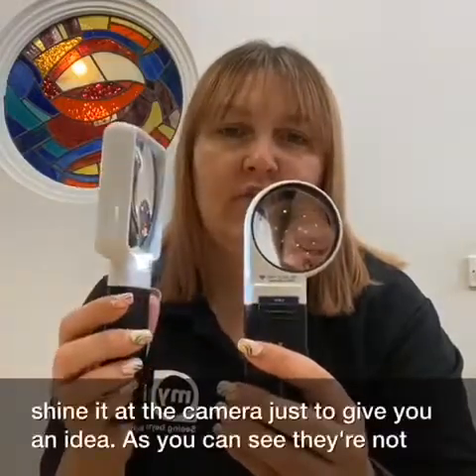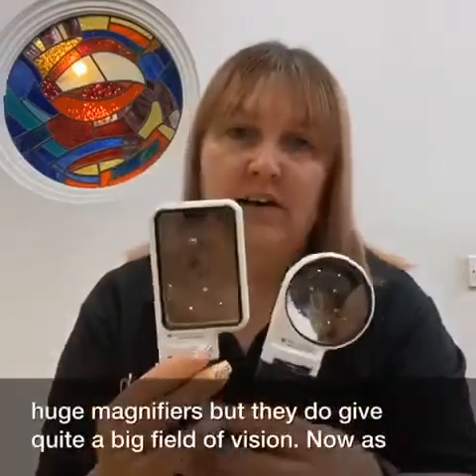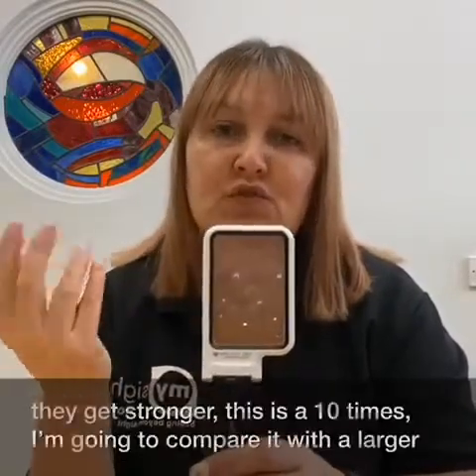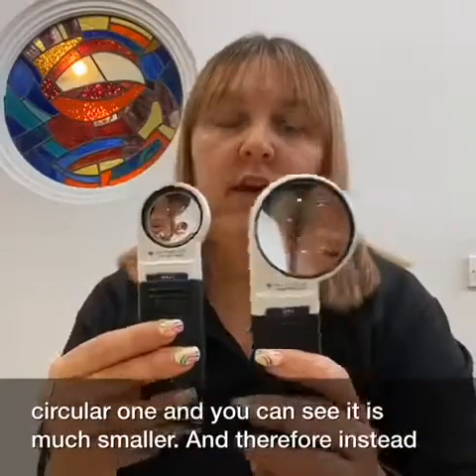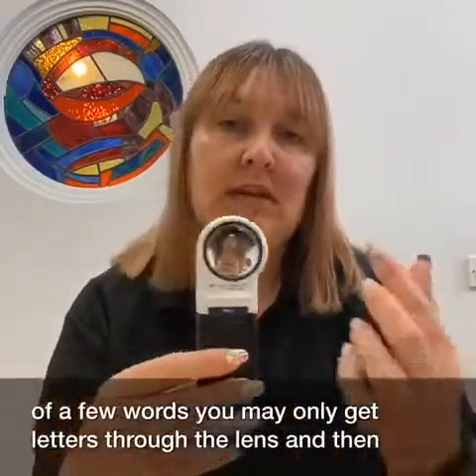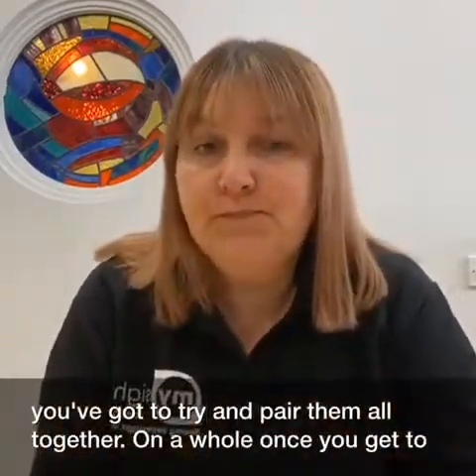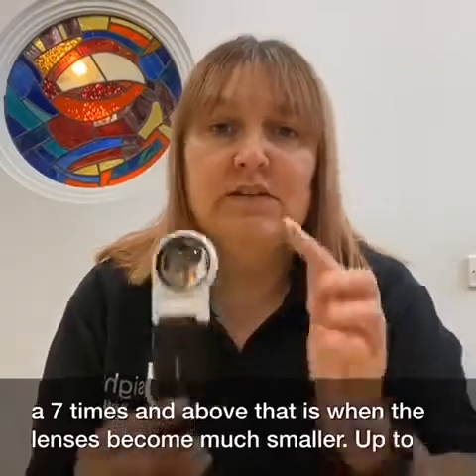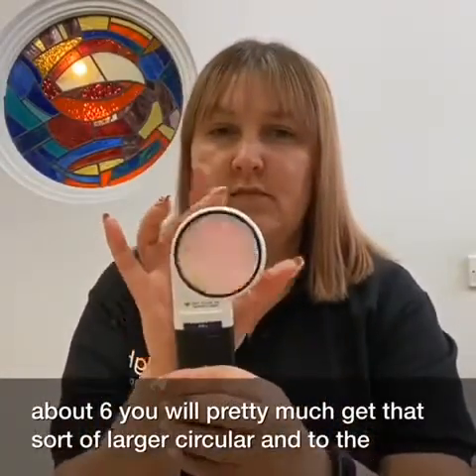I don't really want to shine this at the camera, just to give you an idea. As you can see they're not huge magnifiers but they do give quite a big what we call field of vision. Now as they get stronger — so this is a 10 times — I'm going to compare it with the circular one to give you an idea. You can see that it is much smaller and therefore instead of full words you may only get letters through the lens and then you've got to try and pair them all together.